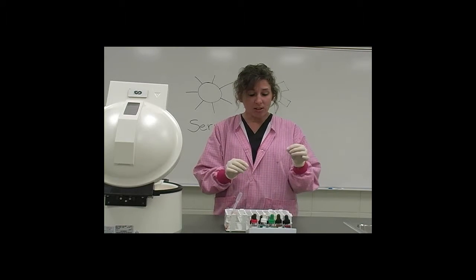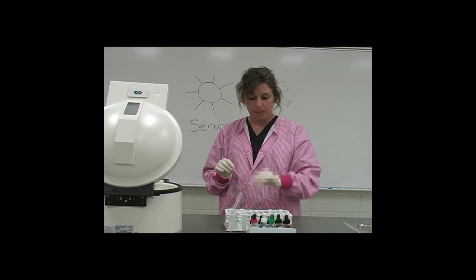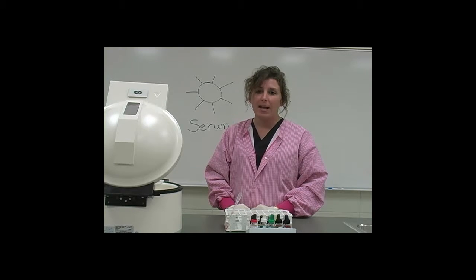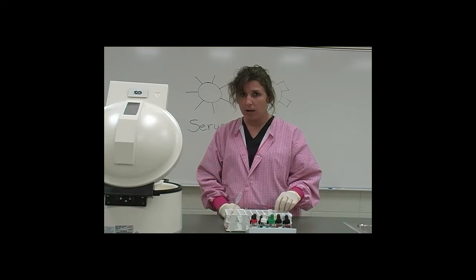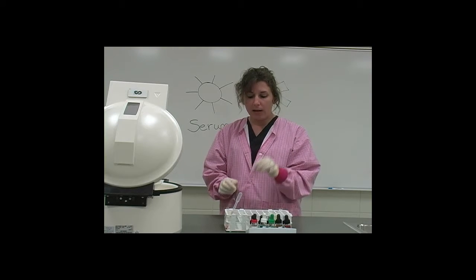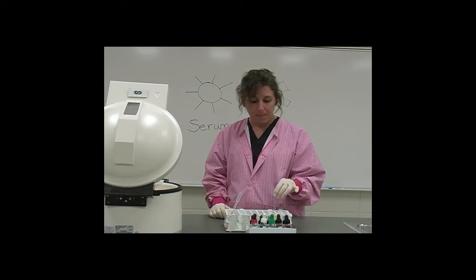So what this simulates is that we have an A positive patient. And this was my blood, so I know that we're correct because I am A positive. Now, in the event that we had a patient that was type O blood, we would see no clotting in the A or the B. If we had an Rh negative person, we would see no clotting in the D.